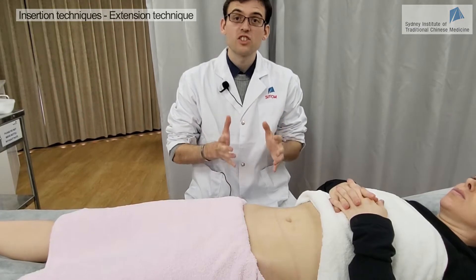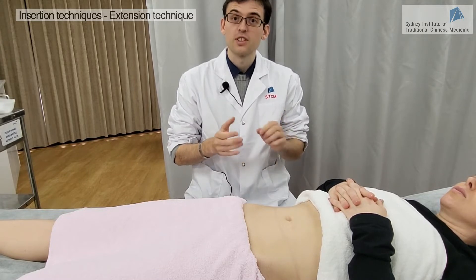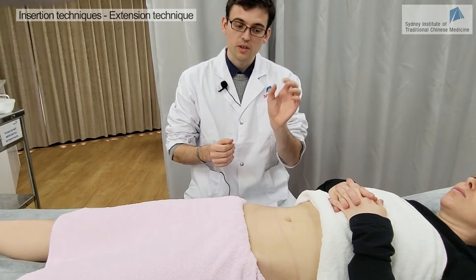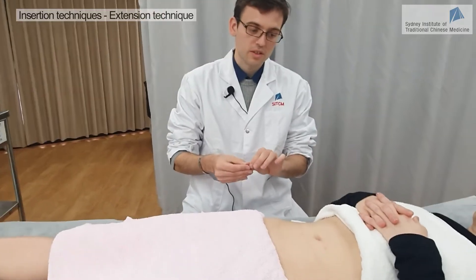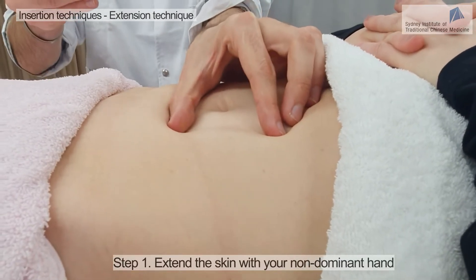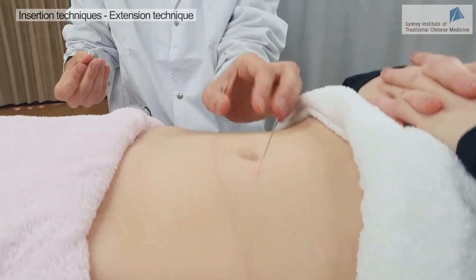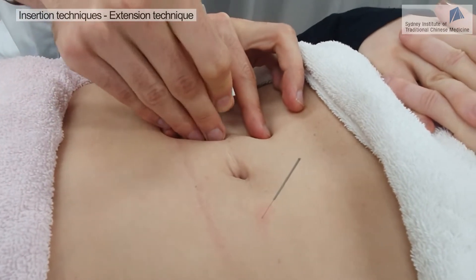I'm going to show you the extension technique now. The extension technique is very useful when you are needling an acupuncture point located somewhere where the skin is very loose and soft. Basically, the idea is to extend the skin with your second hand, and then you can insert with the other hand. With your second hand, you stretch the skin this way, and then you insert the needle. You stretch — the skin is very stretched thin — and then the needle this way.